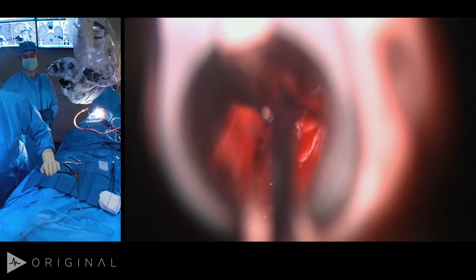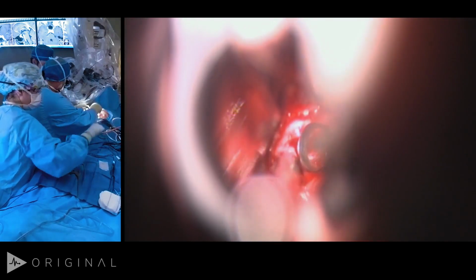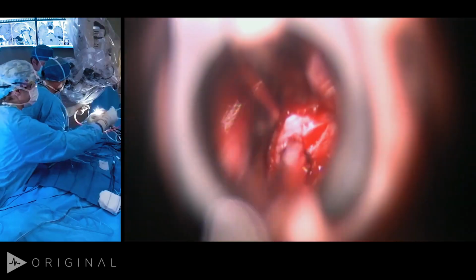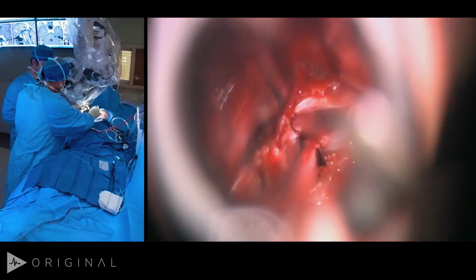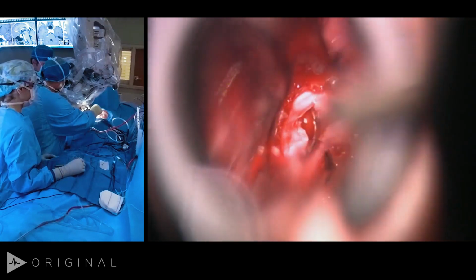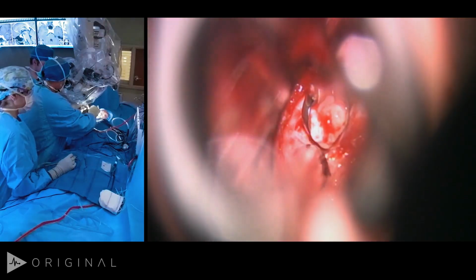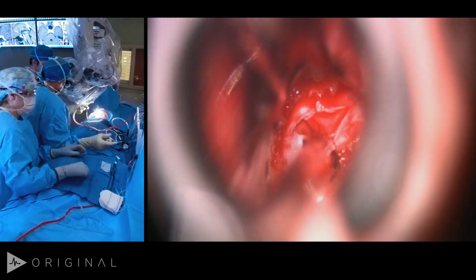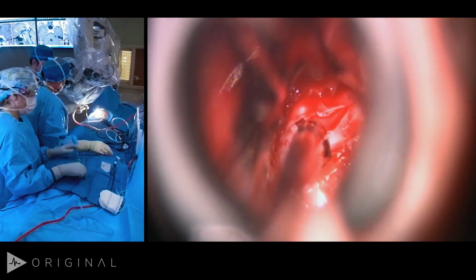When you have Cushing's disease, the pituitary gland can have something called Crooke's changes, which can sometimes be hard to distinguish visually from an adenoma. But that looked pretty convincing to me. So I'd sure like to get some pathologist specimen there. There's some bleeding from the dural edge that I'm not terribly concerned about. If you look through the ring, that's the normal gland. It has that pinkish color to it. Again, since she's a young woman, it'd be nice to take out the tumor and preserve the normal gland. That's posterior gland there. See that whitish there? I don't like to see that too much. So you can actually see the separation between the anterior and posterior pituitary gland.